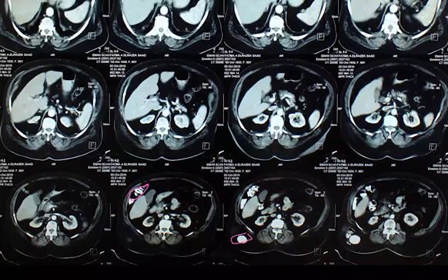Lumbar hernia again. طبعا lumbar hernia is nothing to worry about. You have to forget about them. You never encounter them. لكن اهو two unusual lumbar hernias that you've seen.